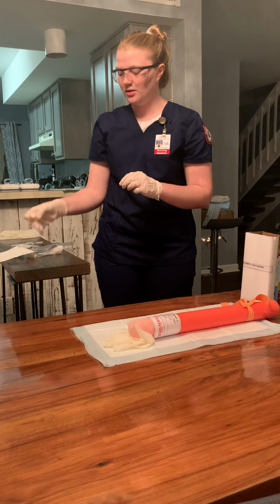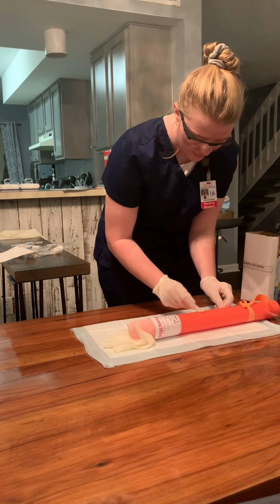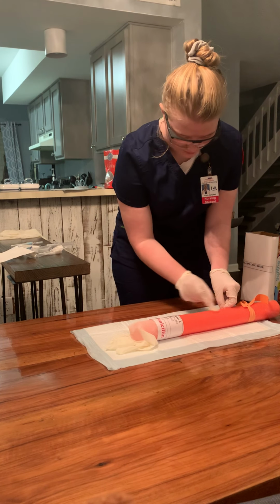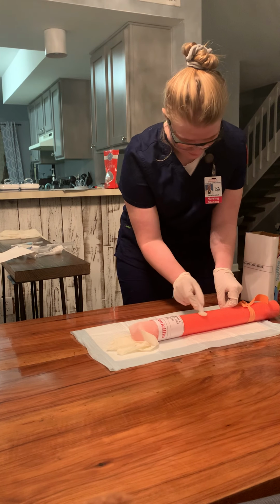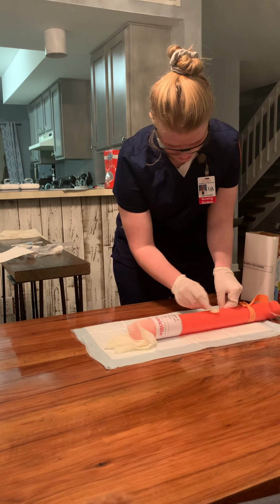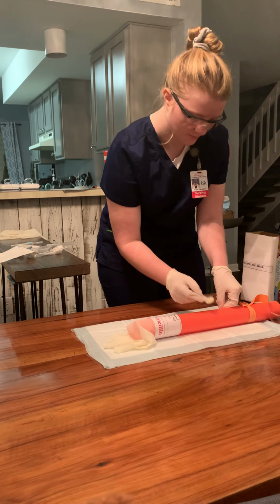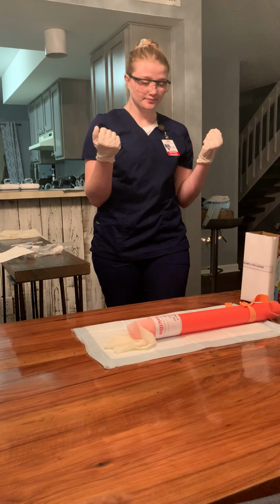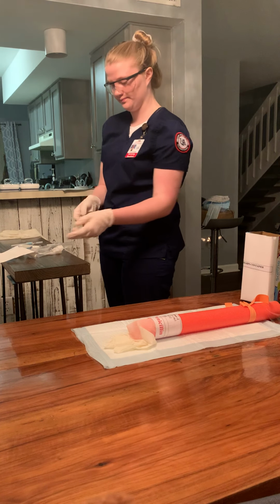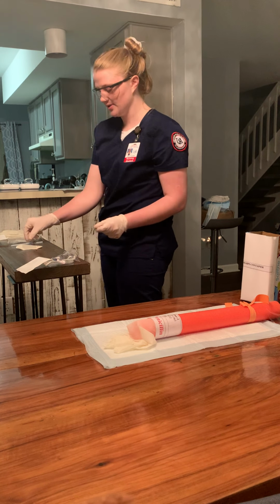I would take my ChloraPrep and scrub for 30 seconds with friction, making sure to go in all kinds of directions. And then I would dispose of this and let it dry completely without fanning or blowing on it. And so I'm just going to move my saline lock closer.